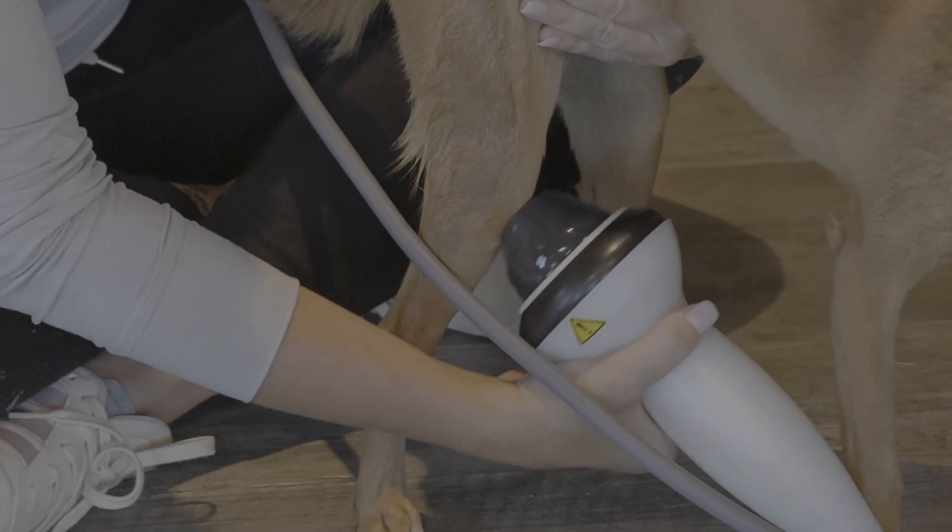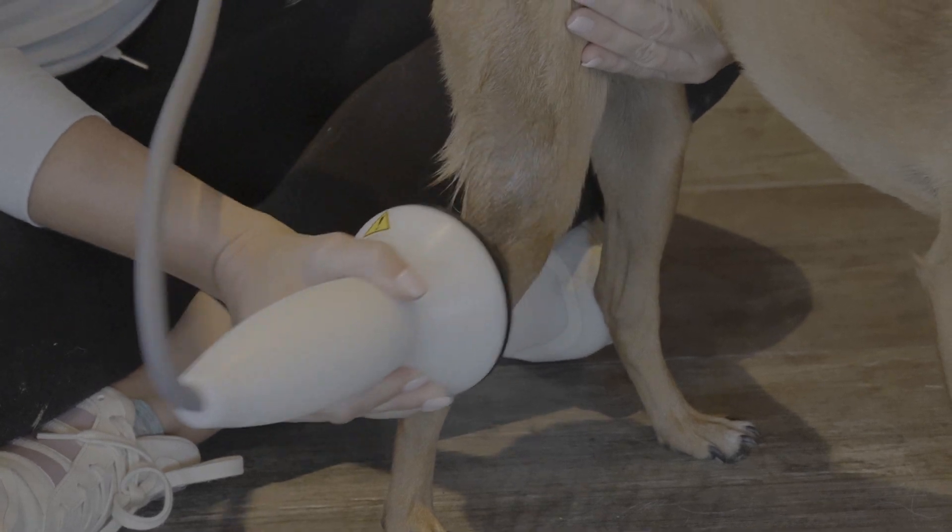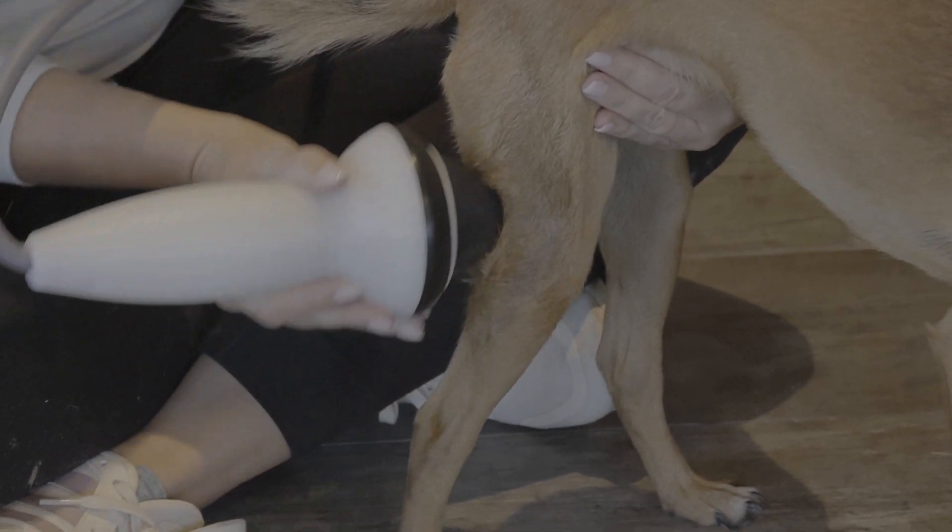I want to do a whole column all the way around the knee, making sure that I'm slowly moving and keeping good contact all the way around the joint.